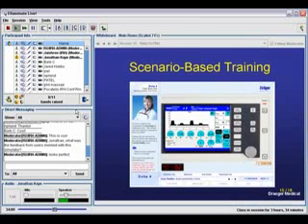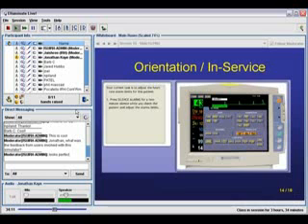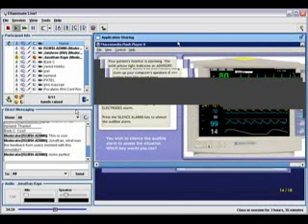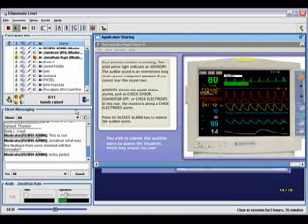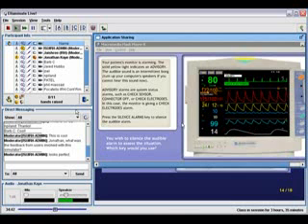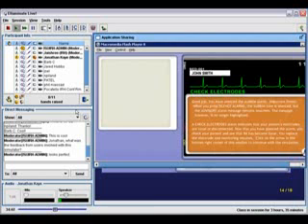What I was going to show with the previous one is just another example. This is now a bedside monitor. Let me open this one here. In this one, I don't know how smooth the animation is, but you might be able to hear in the background the patient monitor is alarming, and we have to go through and silence the alarms and actually go through.